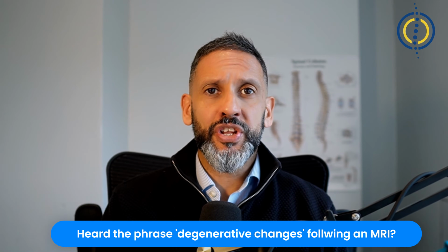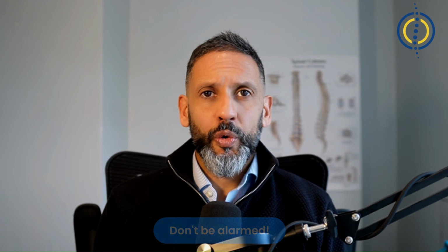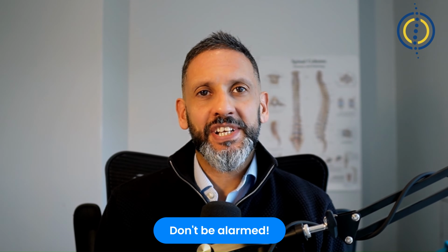If you are over 50 and you've had an MRI scan because of your back pain or other symptoms related to your spine, there's a good chance the report has mentioned the phrase degenerative changes. Whilst this phrase might sound worrying, most of the time it actually isn't.